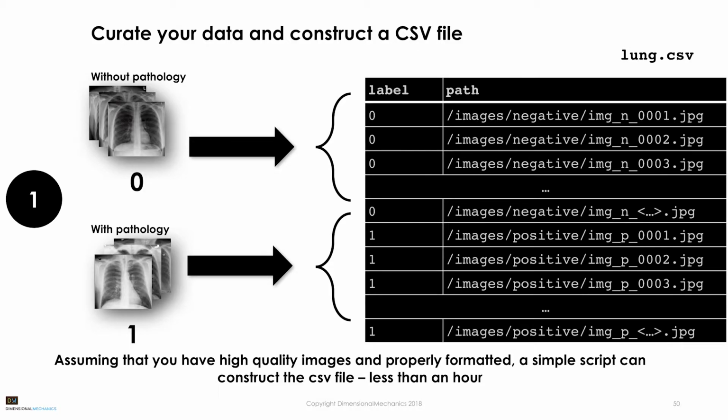So this would be how you would use it. This is an example of very simple image analysis. So we have two cases, without pathology or with pathology. My wife is a radiologist, and so when I put tumor versus no tumor, my wife was not very happy with that because she said, no, an AI determines pathology, not whether there's a tumor or not. It's just whether something's suspicious.